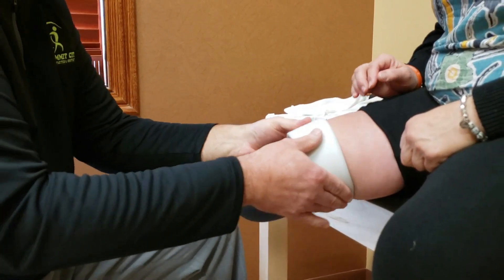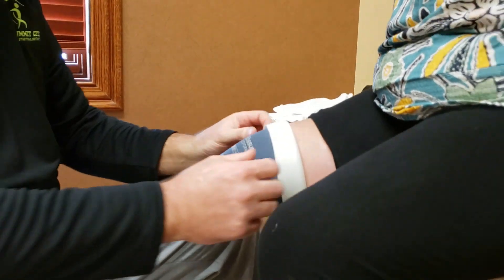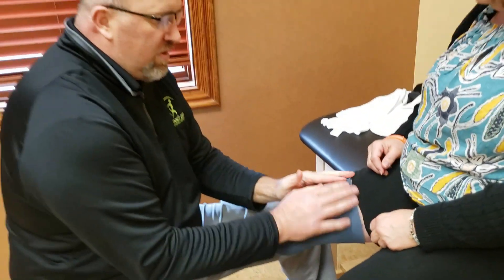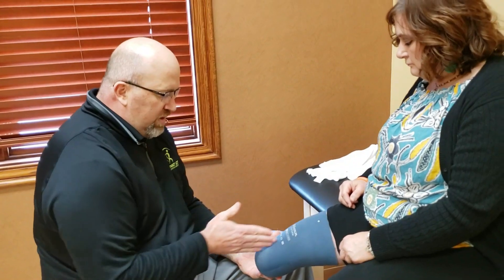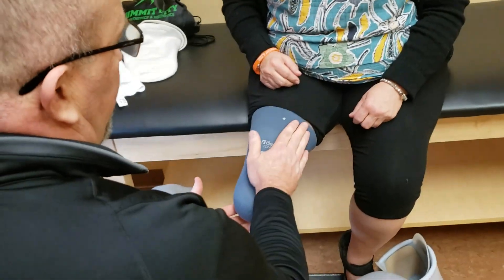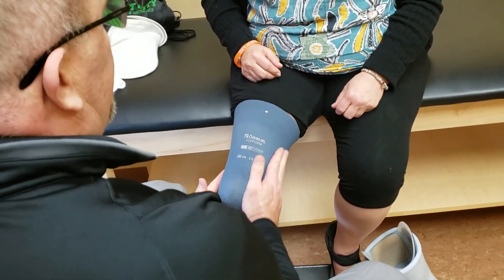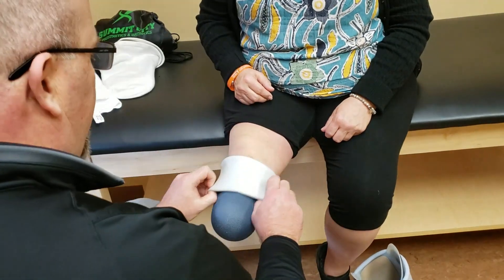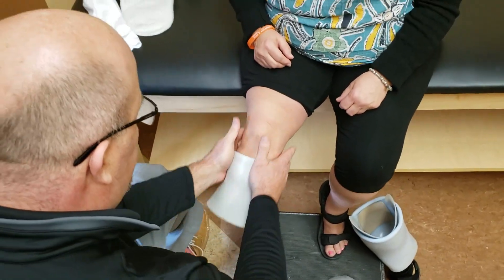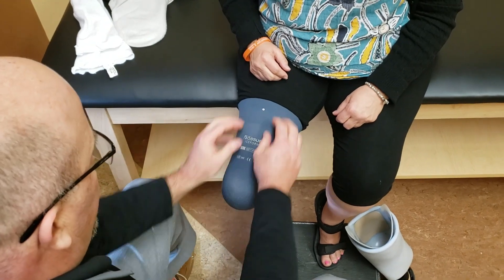Now with the liner already trimmed to the appropriate length, you can see the writing is down the front — it's ever so slightly off to the inside edge, which is acceptable. You would not want the writing on the side of the knee. If you're particular about it and want to reorient, just take it off, move it a few degrees, and try again. You can see the writing is now right down the front.